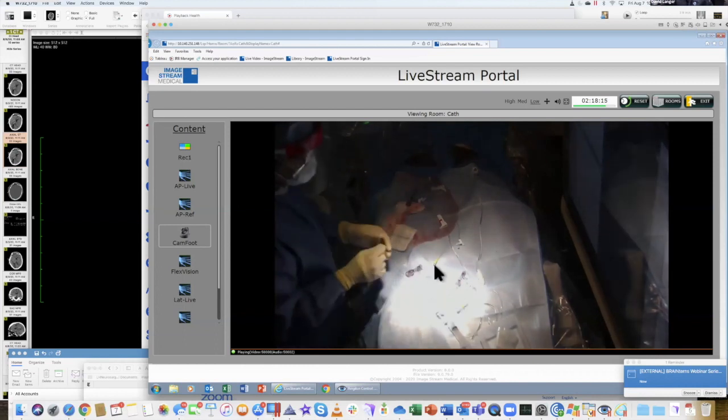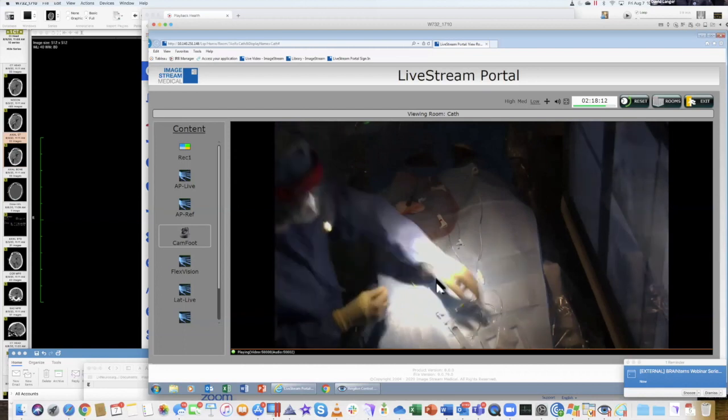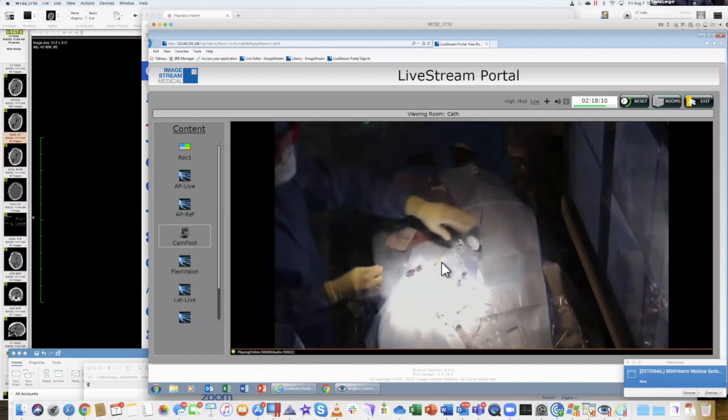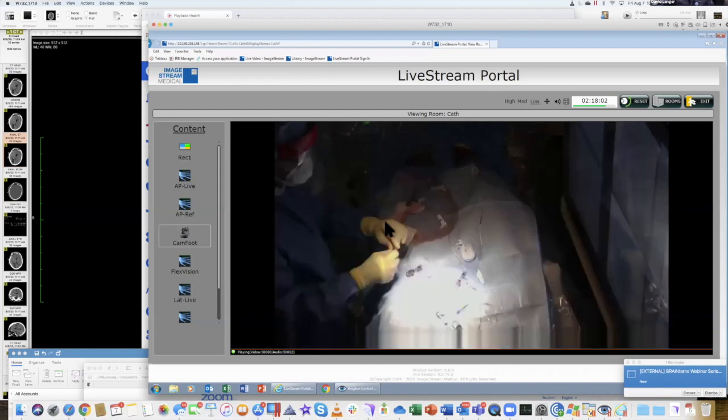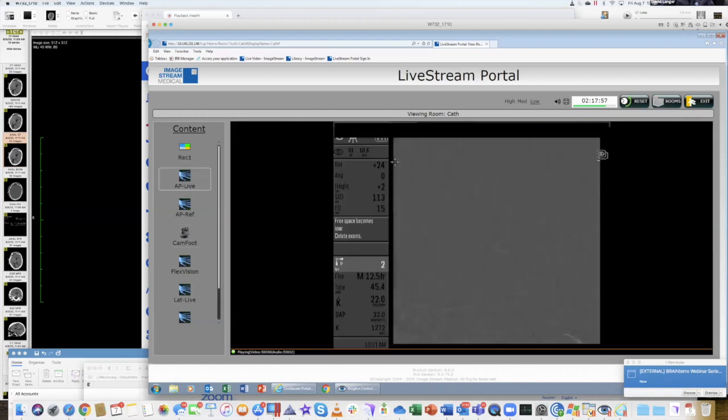So this is the tip of the other microcatheter. He's just wetting his hands a little bit. So now again, he's putting the wire in. It's the thin wire. And again, to make sure the catheter is totally detached from the coil inside the aneurysm. He's advancing, advancing. So he's going to advance that wire up again. You'll see the wire come up. Here comes the wire. And again, just gently pushing the wire just beyond the tip of the catheter, and then pulling the whole thing out.